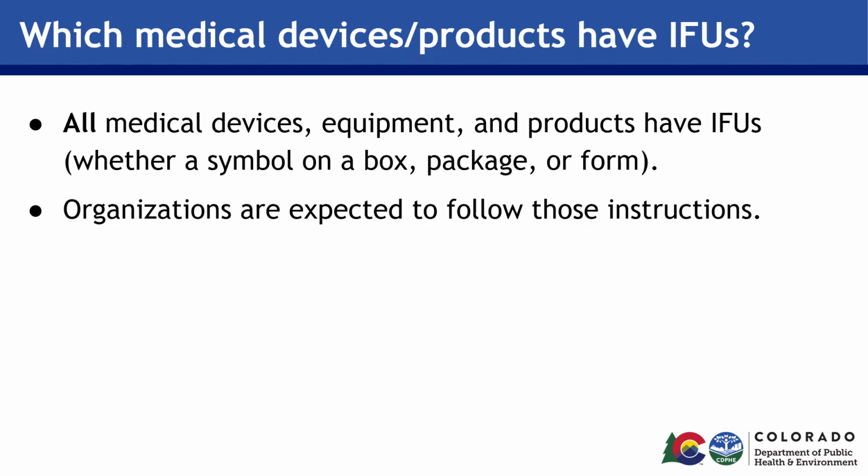It's crucial to recognize that each product and patient care item has its own IFU for things such as cleaning, disinfection, maintenance, and more. If the item does not have an IFU, it is possible that it is not FDA approved, which would be a reason why you are unable to find the IFU. It is a requirement and expectation for healthcare organizations to follow the included instructions.